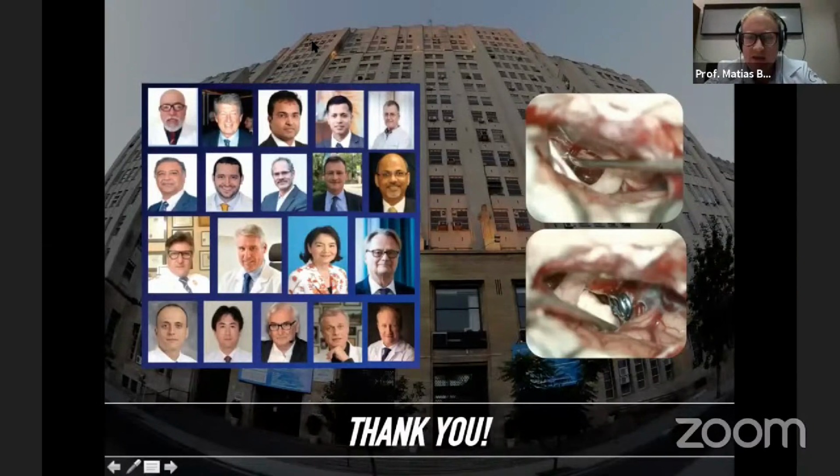Thanks, Ramesh. If we have a very pneumatized sinus, when we perform the craniotomy, we need to treat the sinus in the regular way we use with the pterional or frontopterional craniotomy. Yes. Sometimes we need to open the frontal sinus and we remove the mucosa and we treat it with muscle or with bone wax. Okay, thanks.